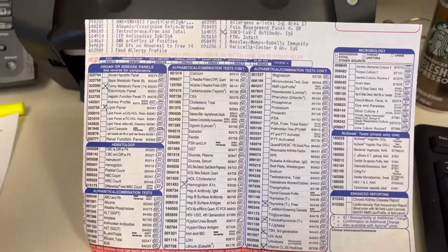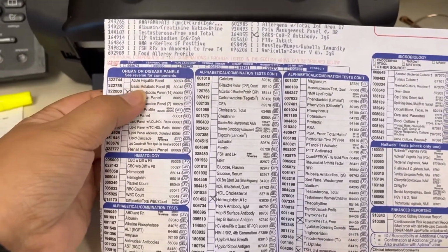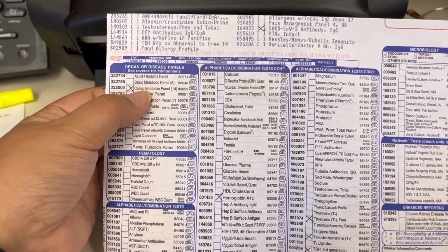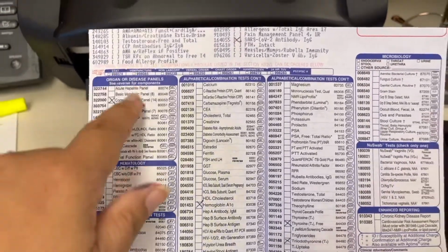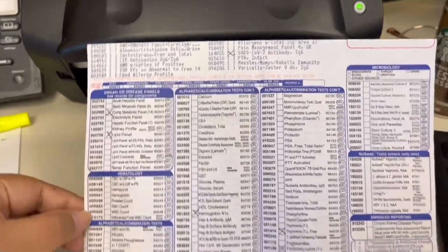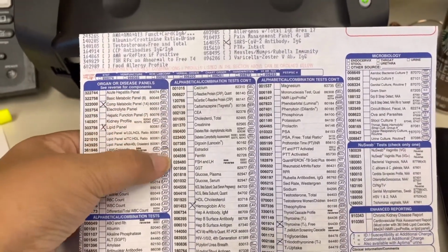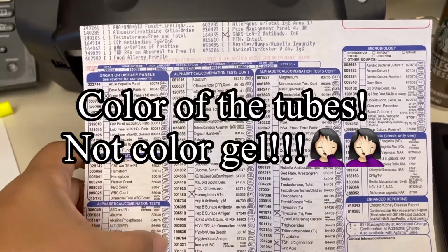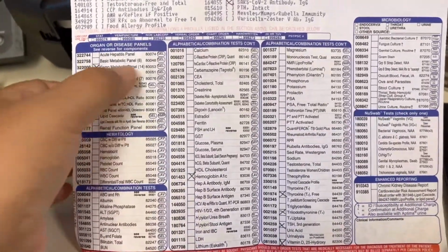But here it'll tell you all of these tests right here: acute hepatitis panel, basic metabolic, comprehensive metabolic. All these right here are tests. All these right here are test codes. And all of these right here are the color gel that you guys need for these tests.